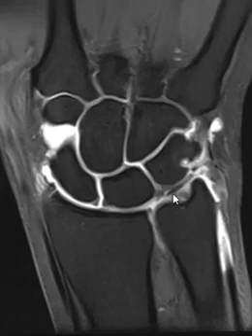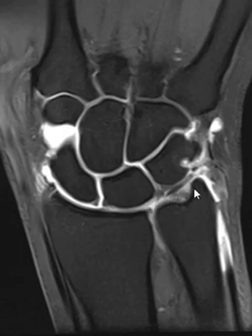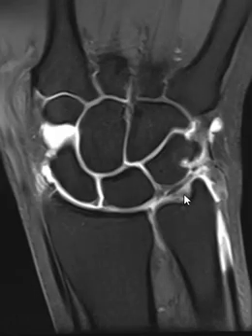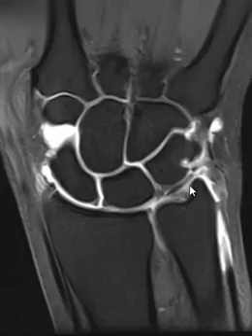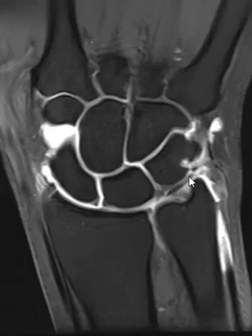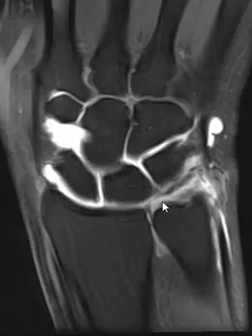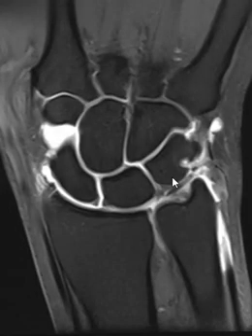The TFCC has several other attachments. One attachment is right over here on the part of the ulna where it's cupped — this is called the fovea. We should see fibers coming down attached to the fovea, but I don't see them attaching to the remainder of the TFCC, so there's a tear of the foveal attachment. It also attaches to the styloid process right here. We see a piece of it coming across and then there's no attachment — contrast is going in between. So there's a tear of the styloid attachment. There are also a couple of attachments to the carpal bones that I don't see, so those are torn as well.